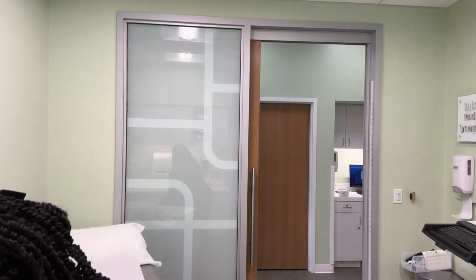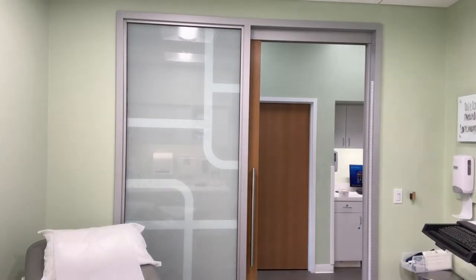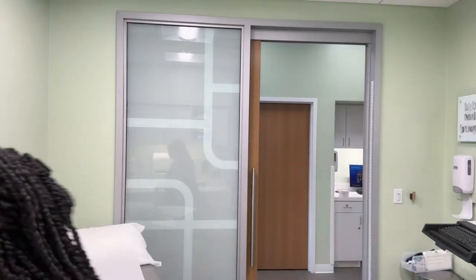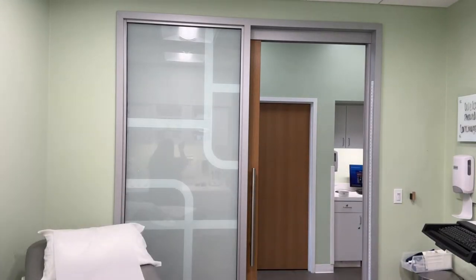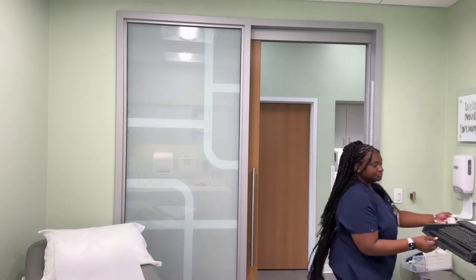Then I go over underneath the cabinets to check if there are any timers and boxes that we need to put the test in, and make sure that everything's done right there. And then I go over to the cabinets, as you can see in my reflection in this little white backdrop mirror. I'm just checking to make sure that every room has tests, every room has some type of wipes that we use, and making sure that everything is straightened up, so when we bring back the first patient, the room is entirely fixed.